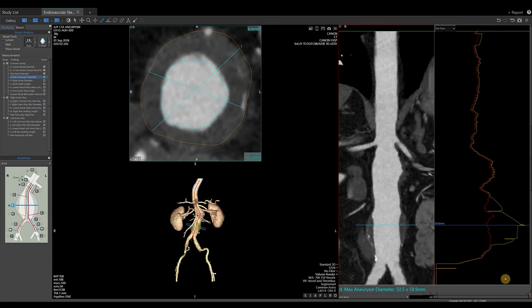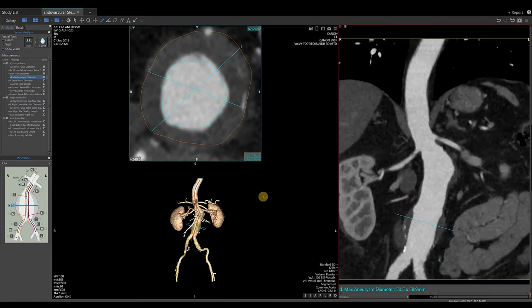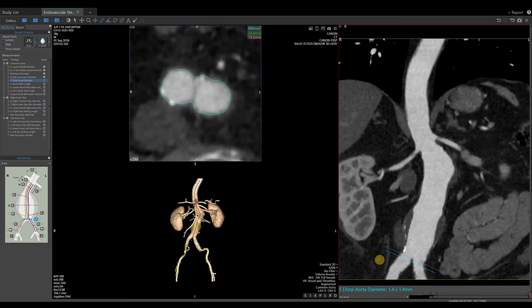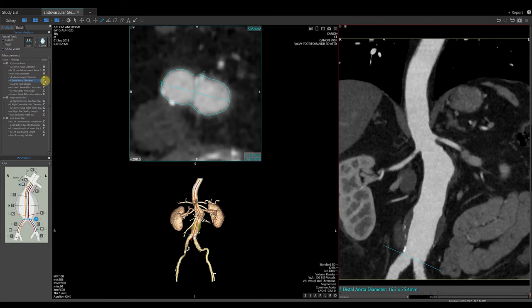To return to our original CPR view, select the red slash in the bottom right-hand corner twice. And in the upper left-hand corner, turn the wall off by unchecking the box. Select our next measurement, distal aorta diameter. If you disagree with the placement of the line provided by the software, roll the mouse wheel and move the dark blue line to the desired location. Once there, grab the light blue line and superimpose over the dark blue line. If happy with measurement placement, check the box to lock the measurement in place and take your snapshot.